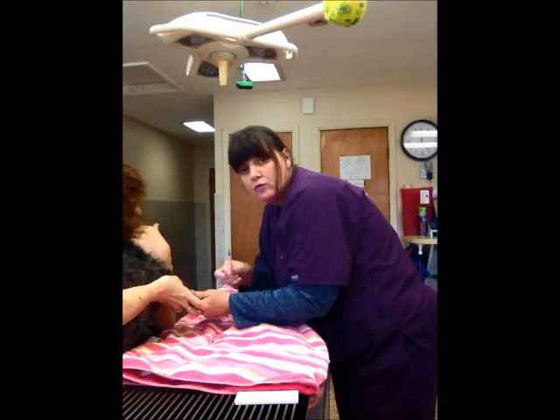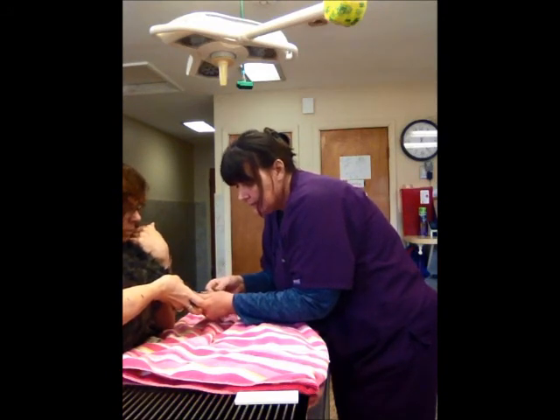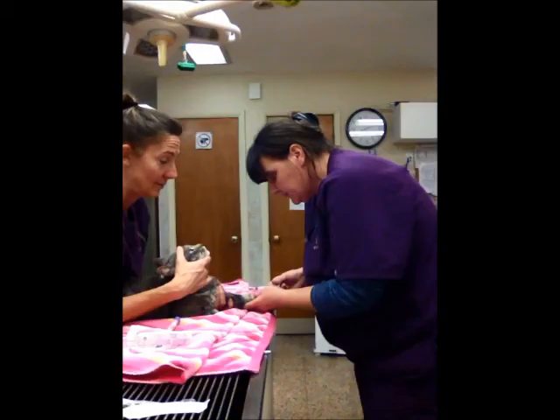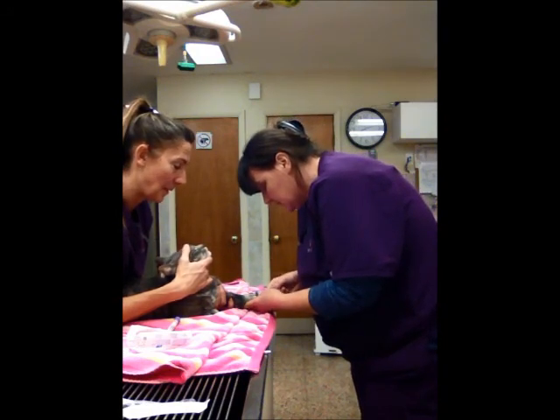And draw blood from the cephalic vein of a dog. I just need a small amount for her hematocrit. Cephalic. Couldn't take the blood out of the cephalic vein very fast.